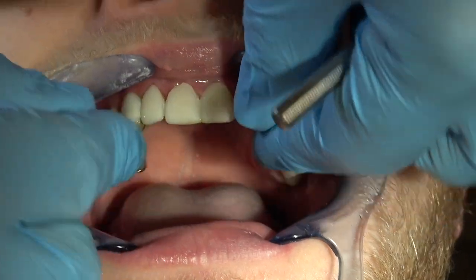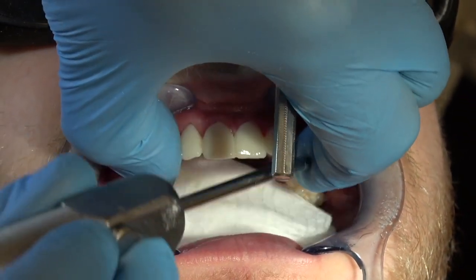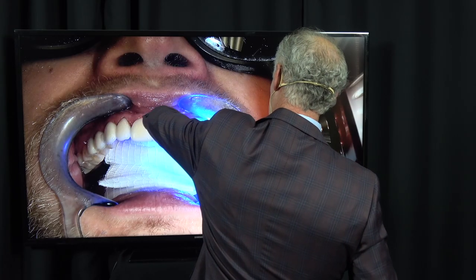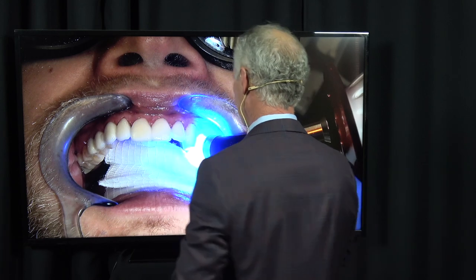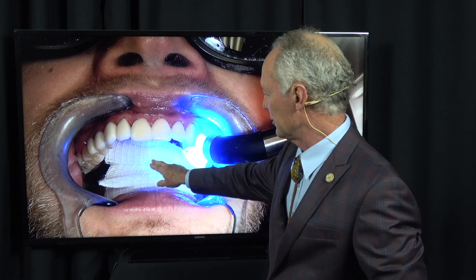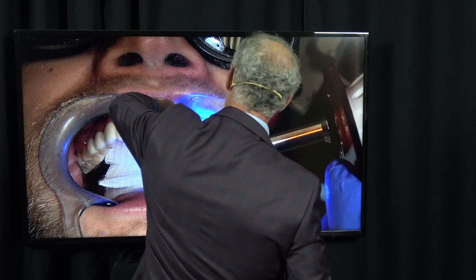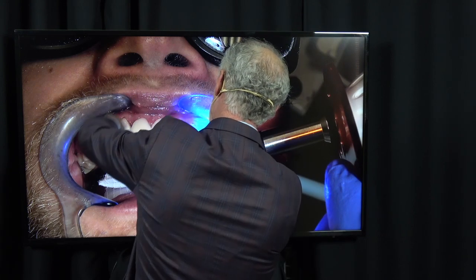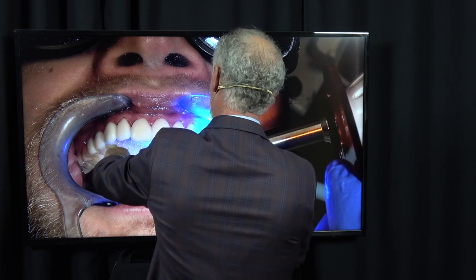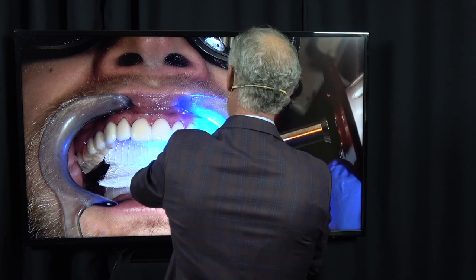I'm wiping the adhesive on the teeth just as a glaze, and then blow the excess off as I put my fingers between the cuspids and the bicuspids to hold it in place. I'm going to take my air syringe and blow the excess adhesive onto a 2x2 that I've placed in the mouth. Then I'm going to continue to hold it as my assistant cures between each two provisional restorations for 20 seconds each.